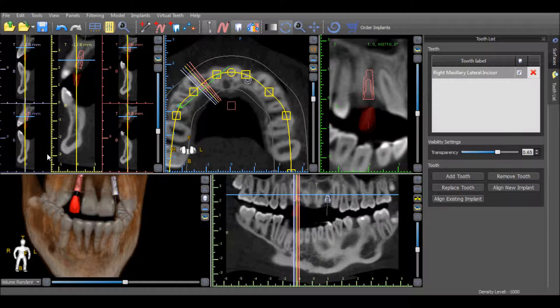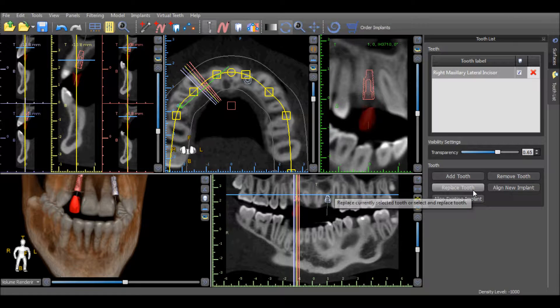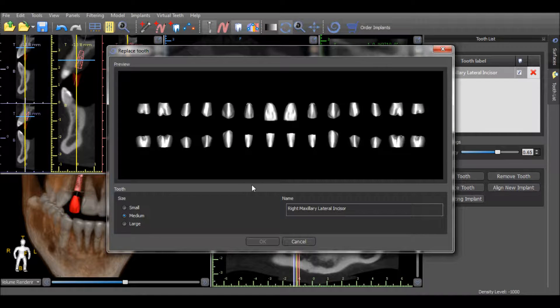The size or the shape of the placed tooth can be changed by pressing the Replace Tooth button and changing the desired shape or size from the options.